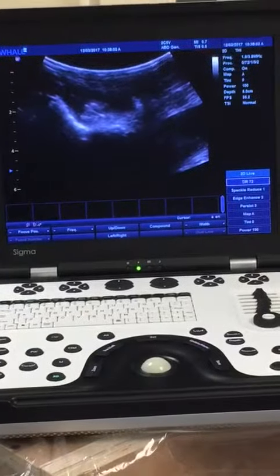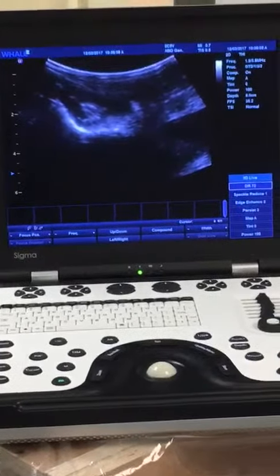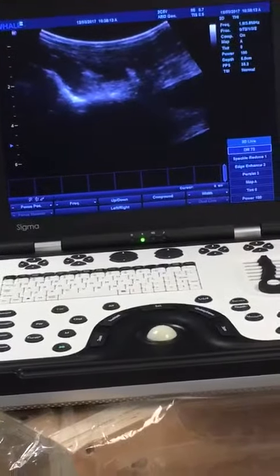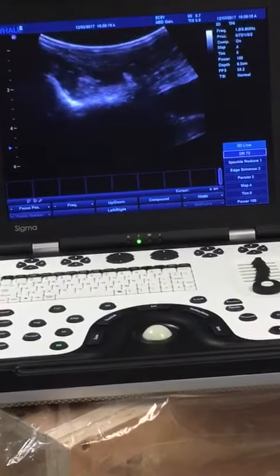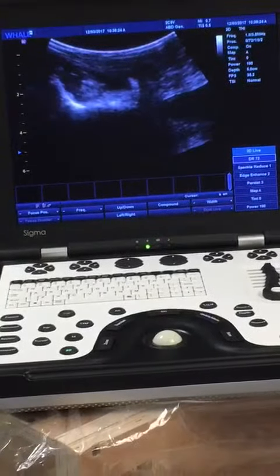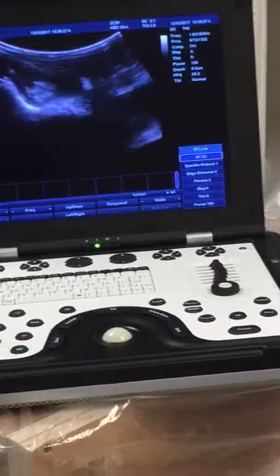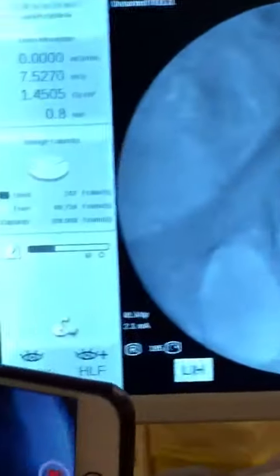It's very important to hit the bone — if you don't hit the bone, don't advance. I'm going to go a bit more steep until I hit the bone. I'm hitting the bone now. Look at the ultrasound image — I'm hitting the bone and it's actually at the iliopubic eminence.